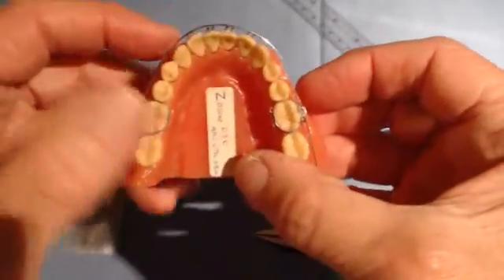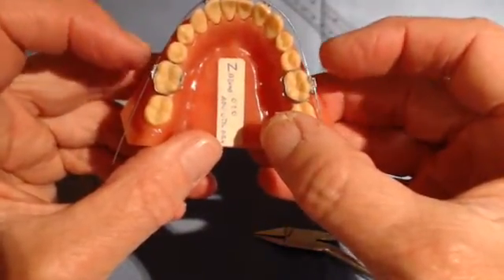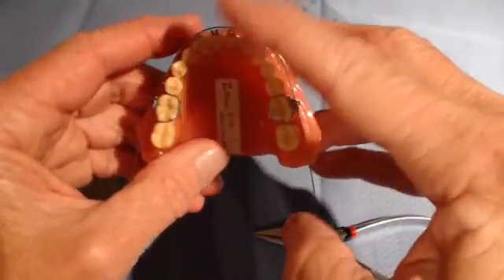The activation of the wire will be to activate the Z-bends on one side or both sides — you can alternate each month; it doesn't really matter how that works, because the effect will be the same. The force on the incisors will be forward.